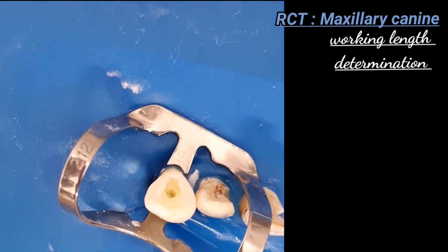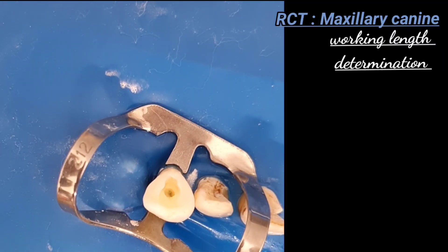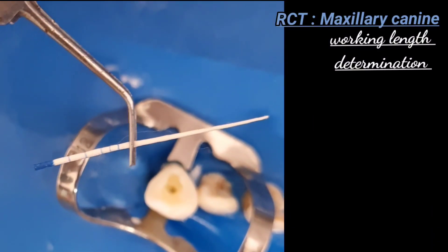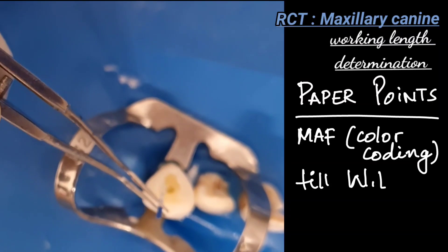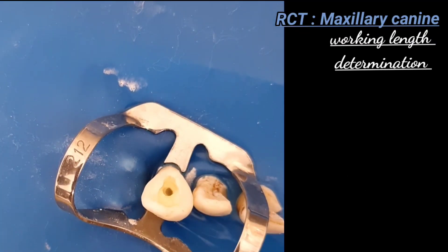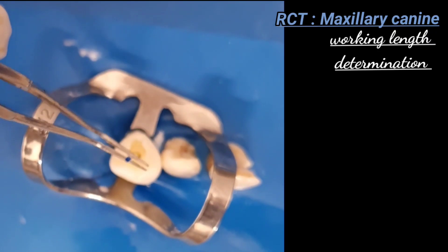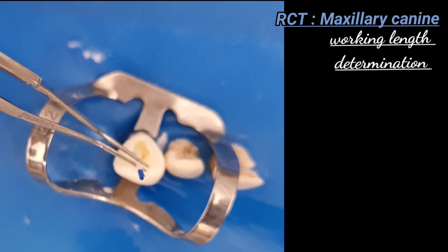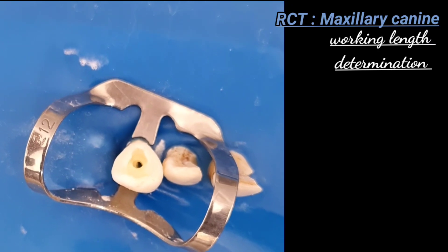All instrumentation is performed with copious irrigation to prevent blockage of the canal with dentinal or pulp debris. Once the body of the canal is completed, GG drills can also be used to further funnel the preparation coronally. Next, paper points are used: matching the master apical file (number 30, blue), insert to the desired working length until you get a dry paper point. We keep repeating the process — if the paper point is still wet, we repeat the step.